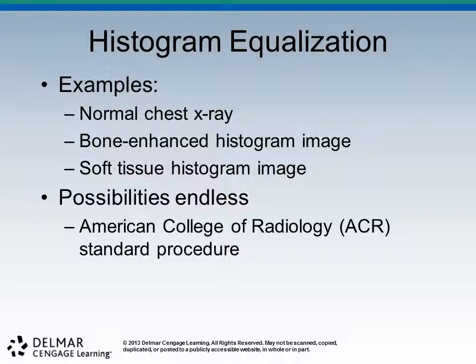You will note that all of that data was present. Remember, we're going from the left to the right, and all of that data was present, and you're only picking, or window and leveling, what it is you want to see. You want to see really high contrast, narrow window, bone. You want to see all the soft tissue, widen that window out, soft tissue. All the same data is there. You're just choosing what to look at.